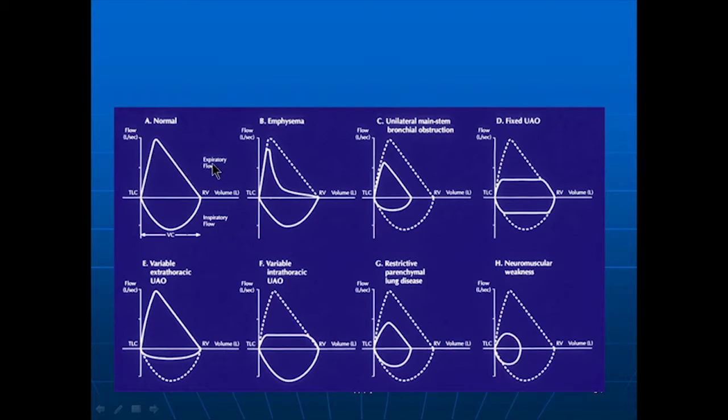When we look at someone who has an obstructive pattern, we're going to be talking about emphysemic patients versus obstructive patients. They have what's called a dog leg pattern. So they have a dog leg pattern. The dotted line represents what is predicted. So this should be their predicted values, again, based on age, height, weight, ethnicity, gender. So that's what is predicted.